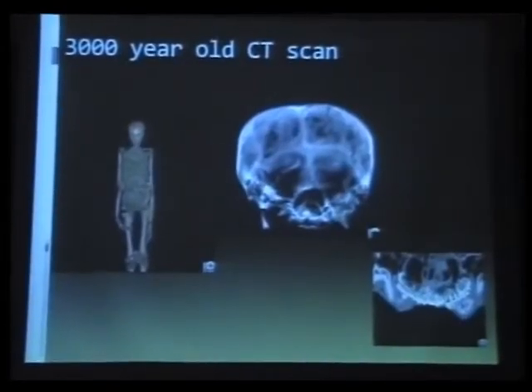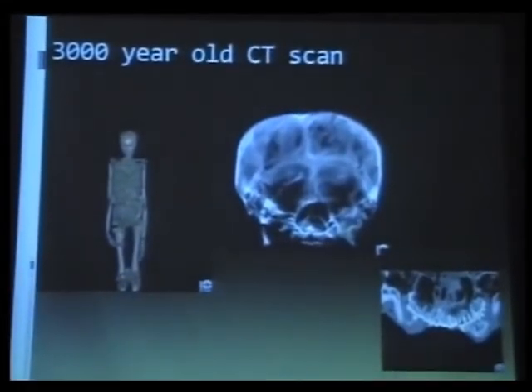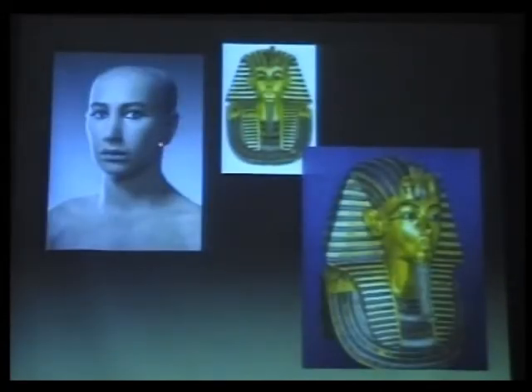This is a 3,000-year-old CT scan of someone from the Middle East. And the scan was done to determine whether this patient was killed or not. And a very famous Egyptologist, employing this Siemens donated unit, scanned the mummy of Tutankhamun. And from that, they were able to generate a reconstruction of the face that matches pretty good the death mask of Tutankhamun. And as a side effect, he was not murdered, at least not from any skeletal CT evidence of injury.